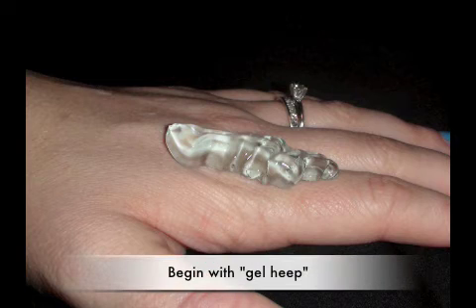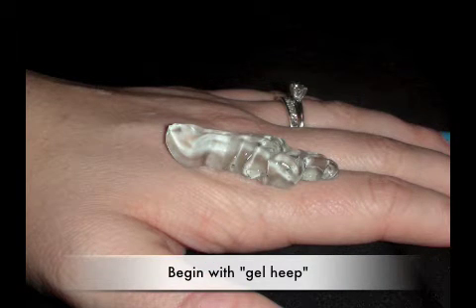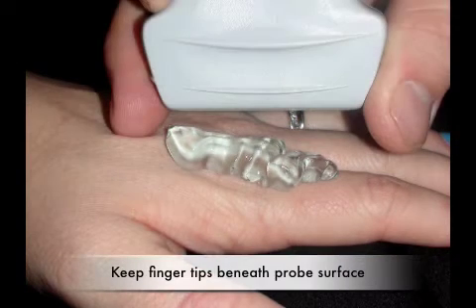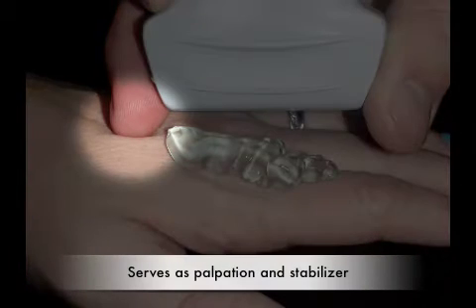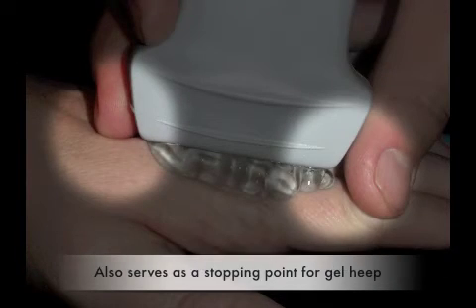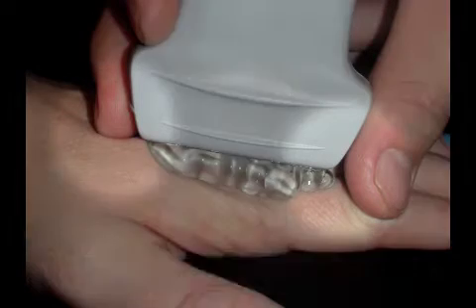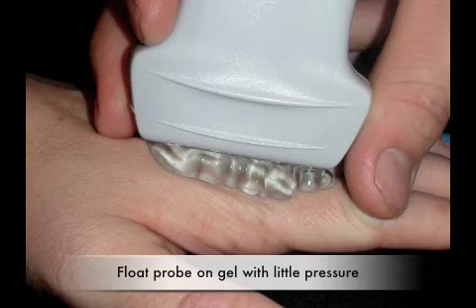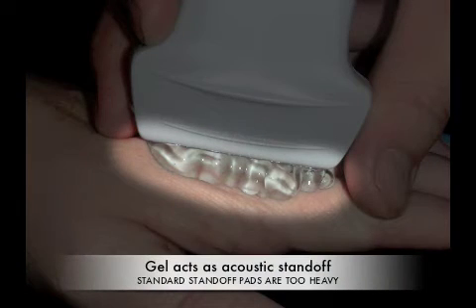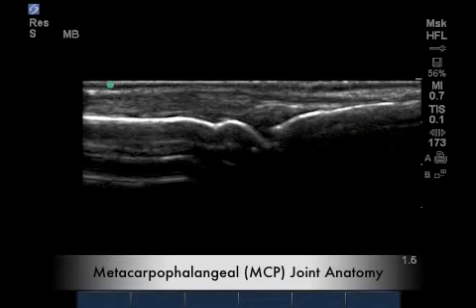Begin with copious gel heaping over the area of interest. First, utilize the index finger as a primary palpation point as well as a stabilizer for the ultrasound transducer. Also, use the thumb as a stopping point for the transducer's depth over the gel heap. Try first to observe this gel heap and the position of the fingers before looking at the screen.